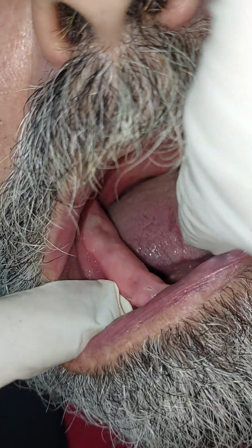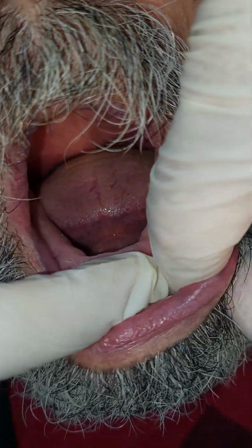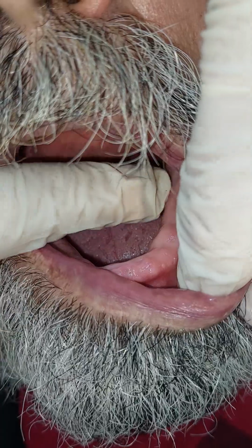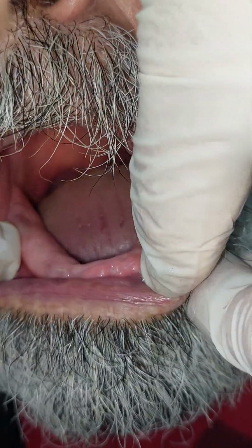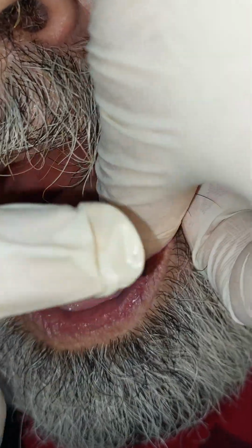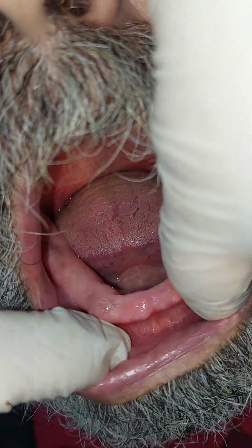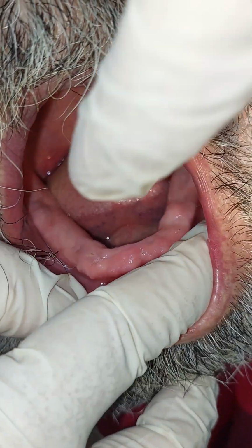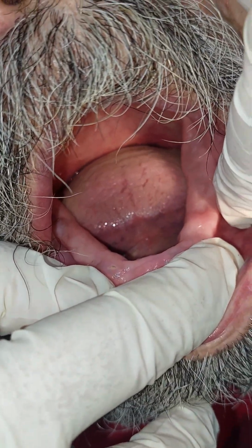Now, what do we mean by encirclement? That these undercuts are going like this, and these undercuts are going from the inside. This is more than 180 degrees. What will happen if I put the material and it solidifies? I cannot remove it. In the previous slides, we talked about options for impression material and what we do with secondary trays. In this video, we're going to talk about surgical reductions.